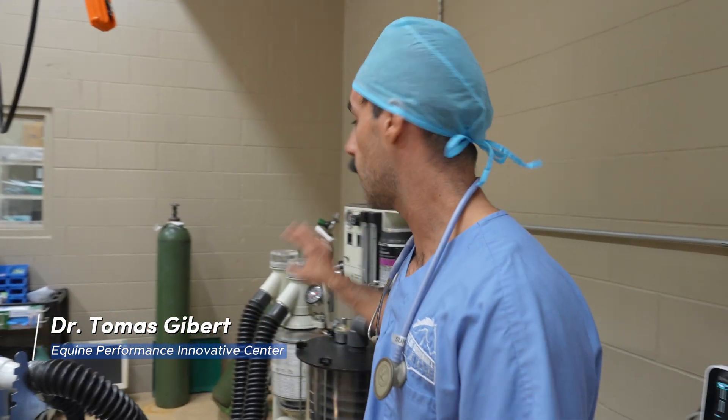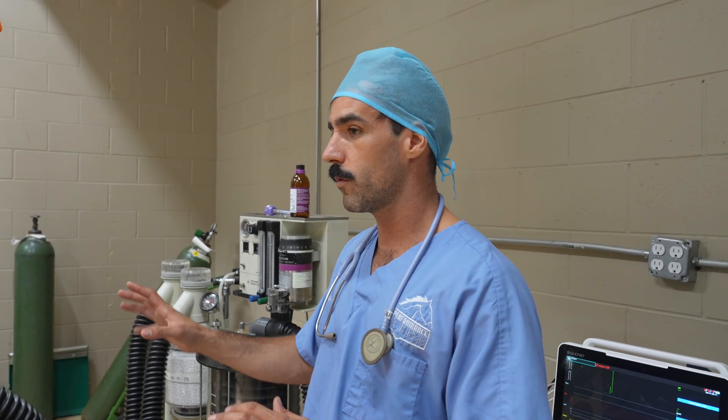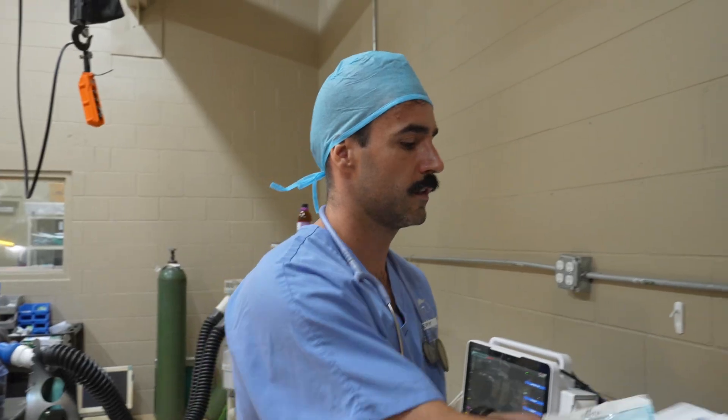We've put the horse on the table and connected him to the oxygen and the inhalant anesthetic. We're getting everything ready to set him up before surgery starts. This horse has a cyst on his left hind pastern, and the surgeon is going to place a screw through it to stop the development of that cyst.